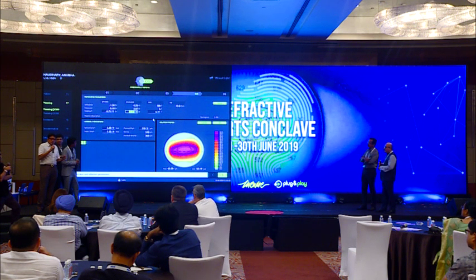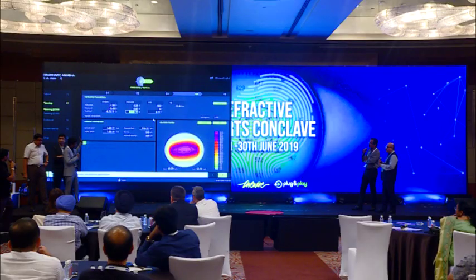Simply because CONTOURA, TMR, half the difference, all these things are based entirely on the anterior corneal surface. That's where the error comes in. And when you start considering other layers, then there is a compromise, and you can't say dogmatically that these are the numbers, so this is what I will do. And Praveen, would you change anything differently?